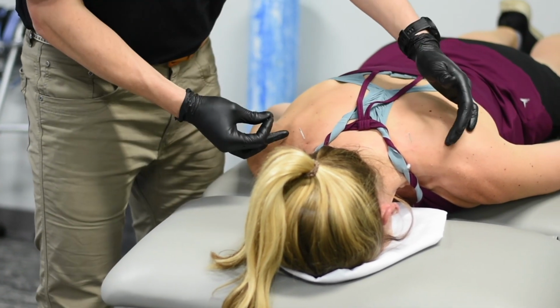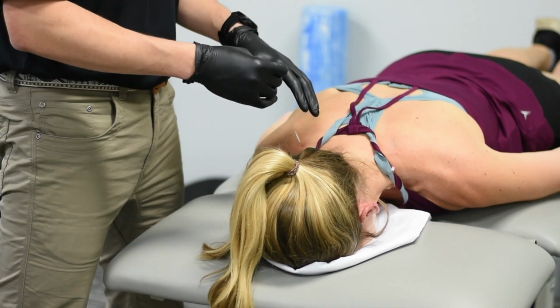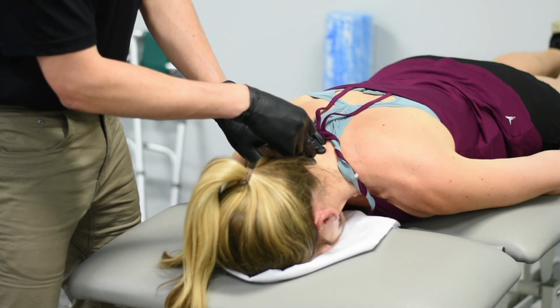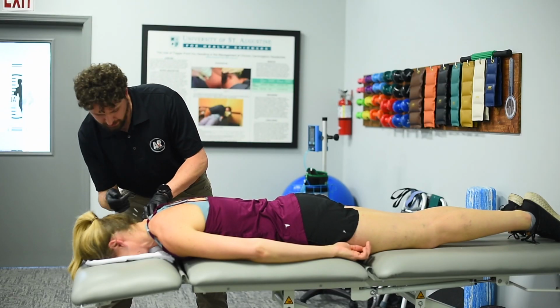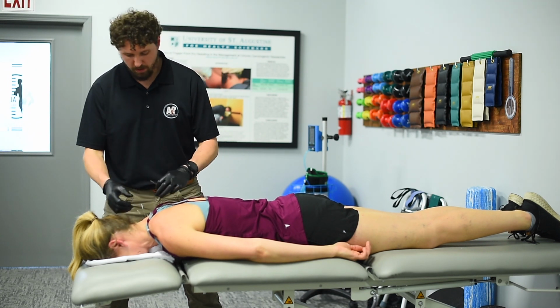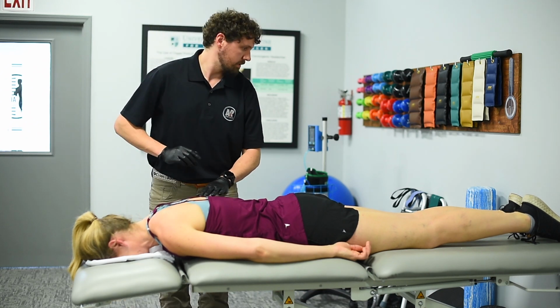So we've hit those two muscles that we tend to be really guarded with a lot of times. Now we'll move in and get right at the junction, right at the base of her neck where it goes into the mid-back. Again, we're just finding the area we want to go. We find that little bone there and go on either side of it. I've kept it close, they can go a little deeper or stay more superficial. From this point, if I need to, I can adjust them, so you're in a safe spot. If you need to adjust or move, you can do that. Okay? Yeah, good.